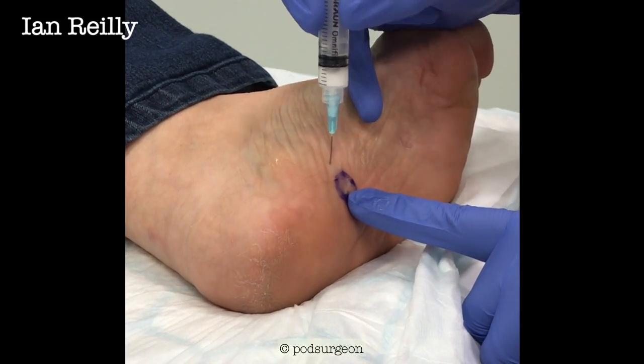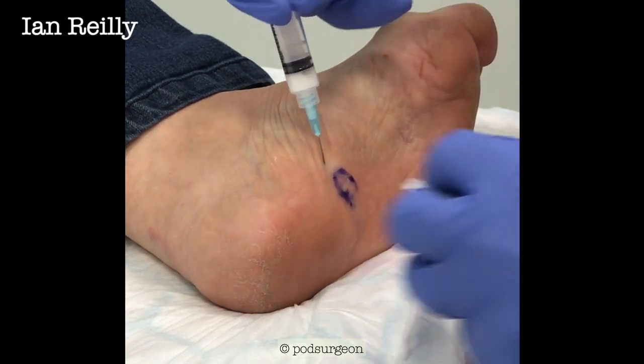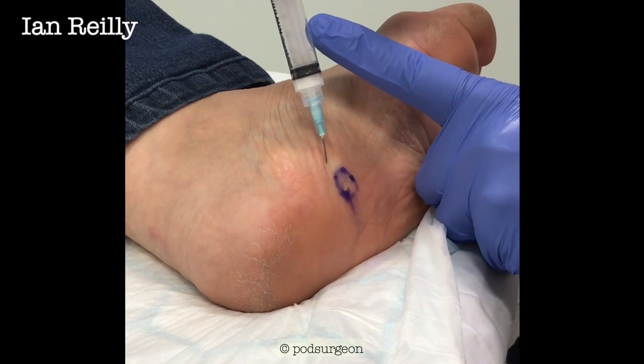Now we sometimes do this under ultrasound scan, but this one's just below the skin — we know exactly where it is. So I'm going to pop a little bit of steroid in there. It's a bit tight — that's why we like a luer lock needle. Ooh, that's tight.